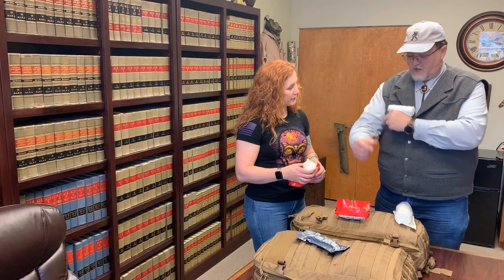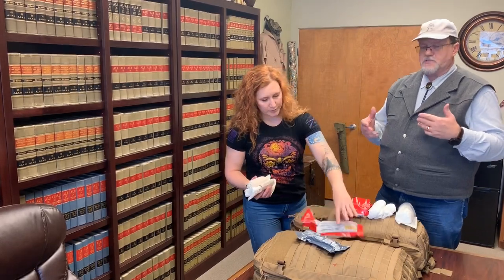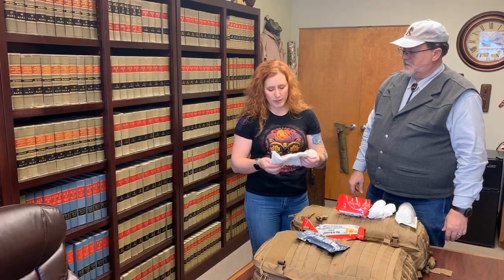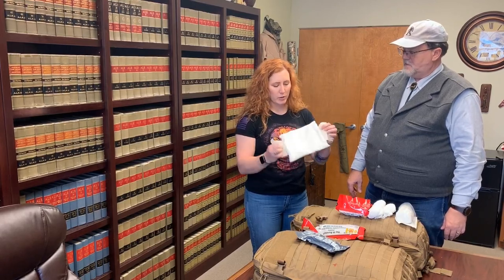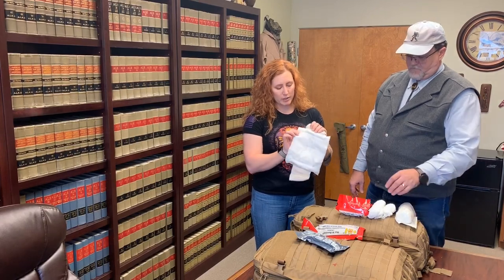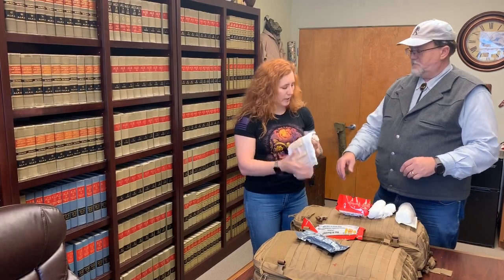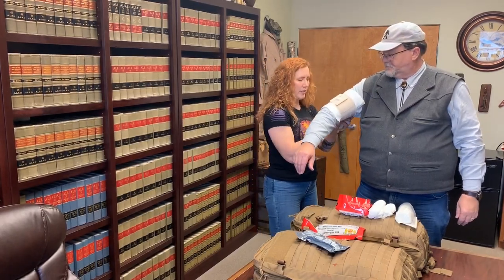So let's say that hole I made with my hand is right here in my arm, and Molly's going to show you this newer type bandage. This new H-bandage — keep in mind I've just been introduced to it within the last month or so — it has a little clip right here that adds pressure and security. It also has Velcro that goes across, and it's got the dressing. The dressing is a little bit wider and thicker than the Israeli bandage, so you get a little more coverage.